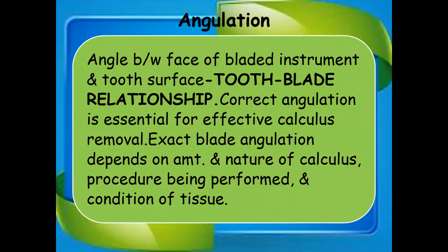Angulation. The angle between the face of the bladed instrument and the tooth surface is known as the tooth-blade relationship. Correct angulation is essential for effective calculus removal. Exact blade angulation depends on the amount and nature of the calculus present, the procedure being performed, as well as the condition of the soft tissue around the working area.